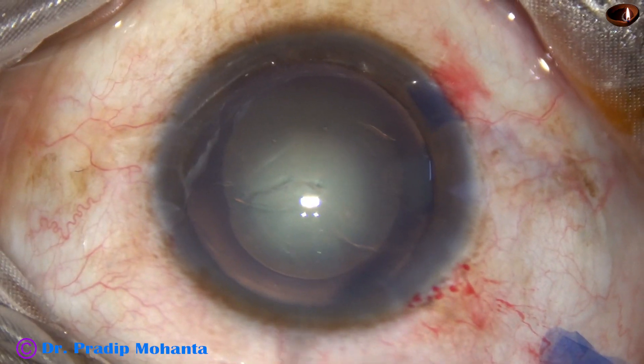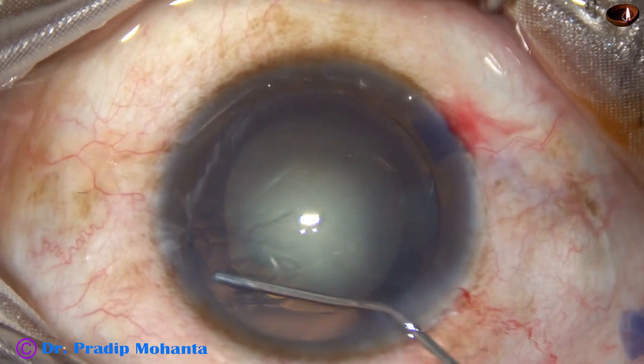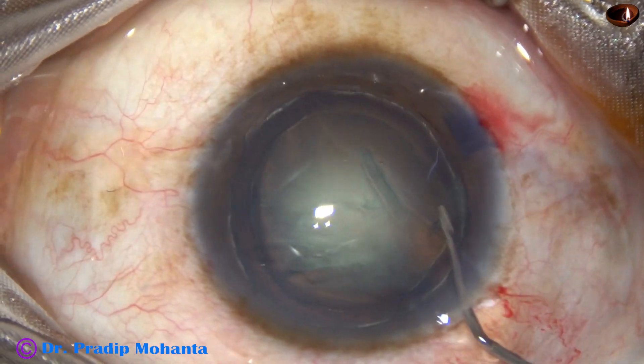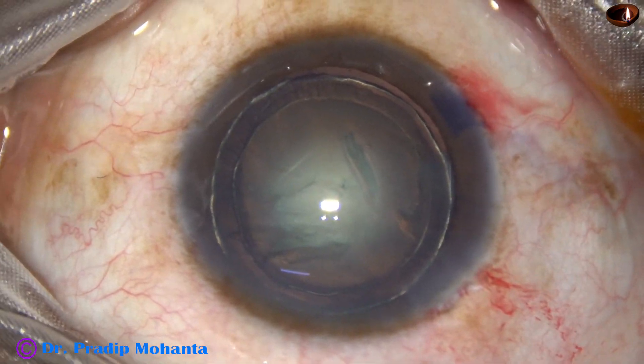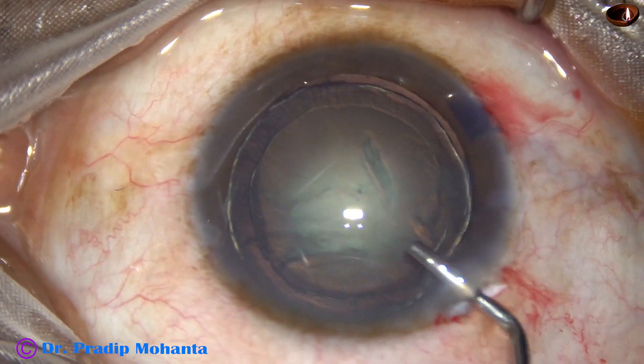Now, hydrodissection and hydrodelineation. This is hydrodissection and this is hydrodelineation. Hydrodelineation has produced a nice golden ring in this case.